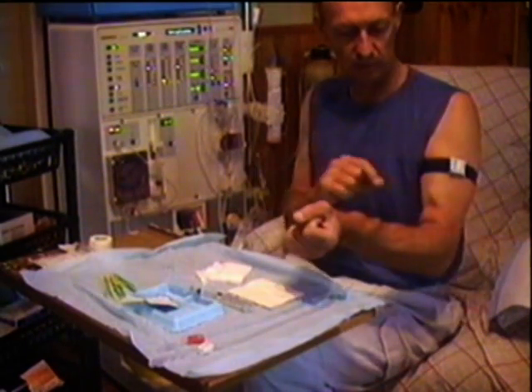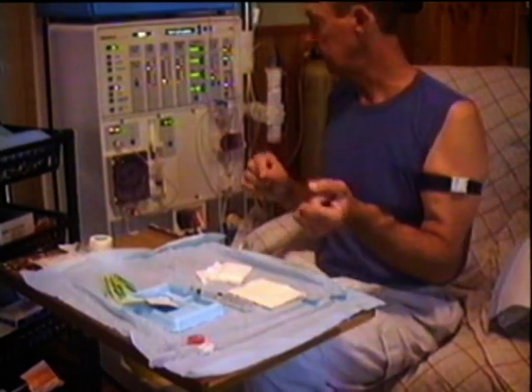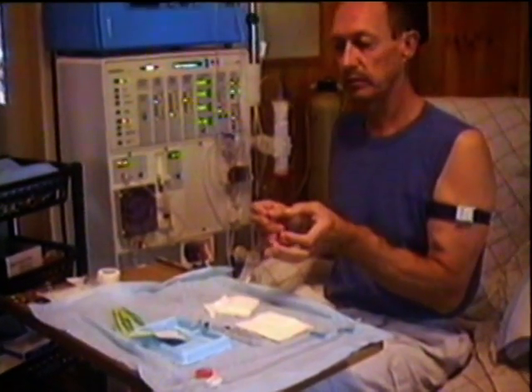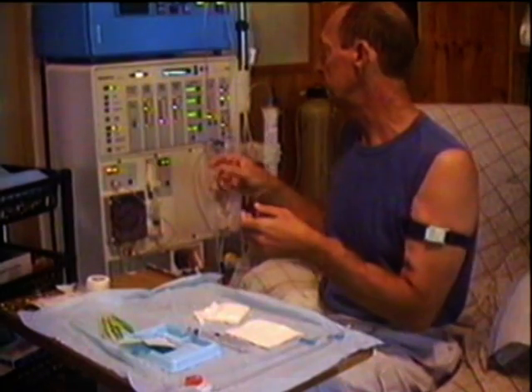Then they'll be ready for me to come back to this table. At that stage I'll put the needles in, connect all the tubing up to my needles, and then we can start taking the blood from my system. The whole thing takes a while — roughly about three quarters of an hour from start before I can get onto the machine.